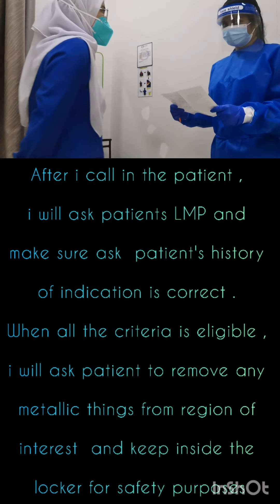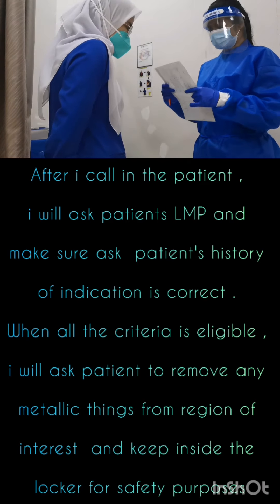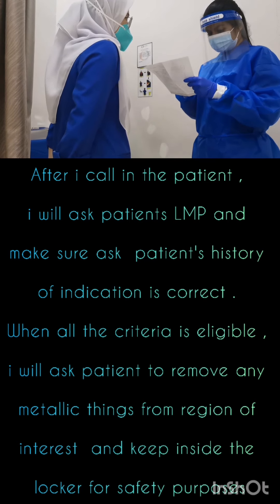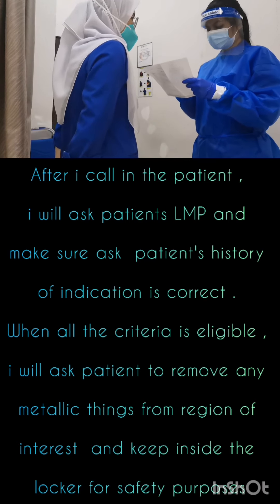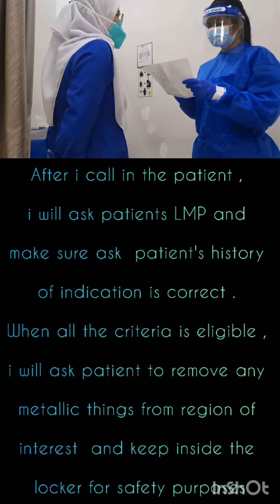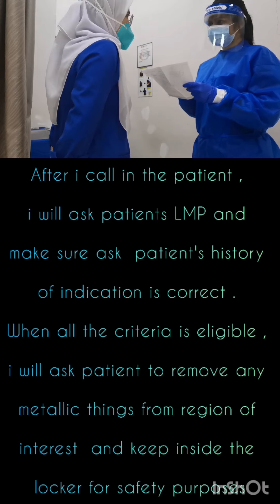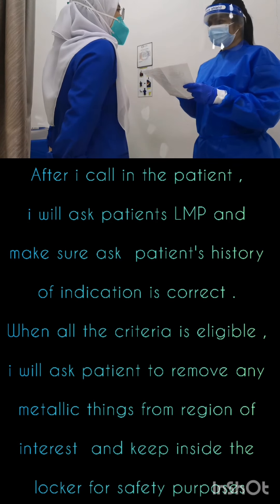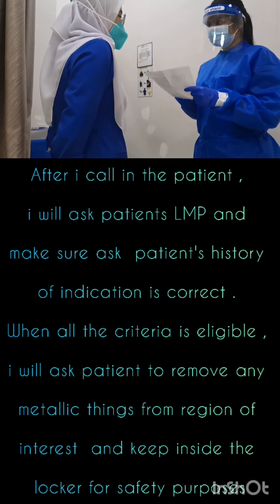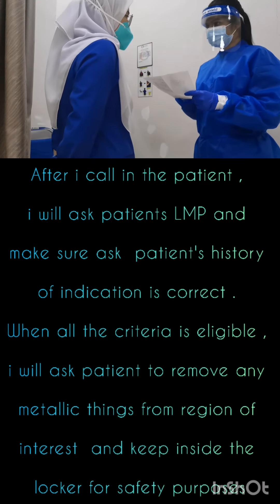After bringing her to the x-ray room, for privacy, I will ask her LMP inside the x-ray room and make sure the patient's history and indication are correct. I will ask the patient about her history of the incident so that I can reconfirm with the doctor if anything has been asked. After that, I will ask the patient to remove any metal items from the foot area so that it doesn't appear in the region of interest.